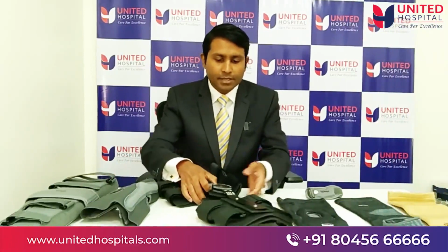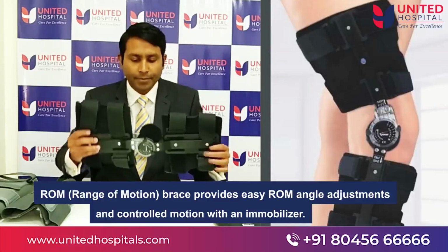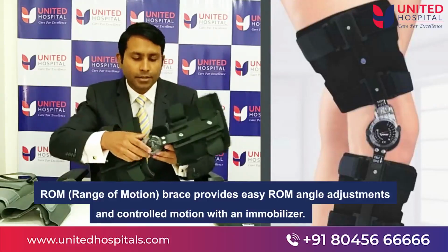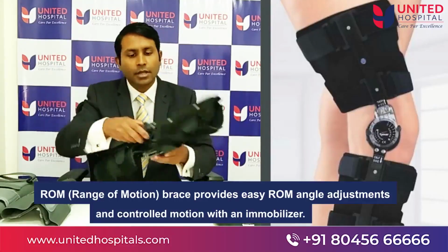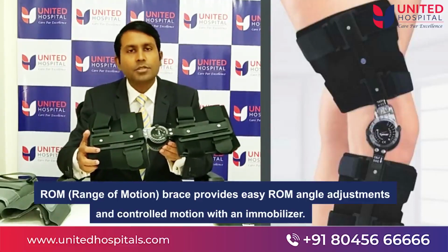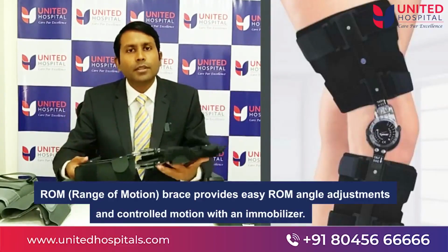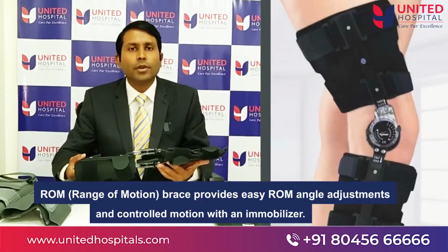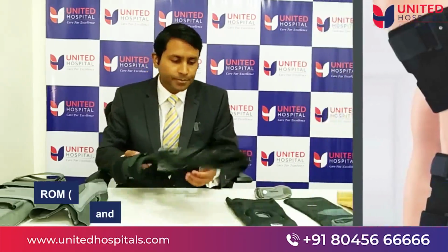The next design is a fairly robust one and is referred to as ROM or range of motion brace. As you can see, it has a circular dial-like device built into it along with these struts on either side and the Velcro straps. What this device does is it allows us to control the amount of bending that the knee joint goes through when the patient uses them, either following injuries such as the anterior cruciate ligament or ACL, or after recent surgeries on their shock absorbers or the meniscus inside the knee joint.